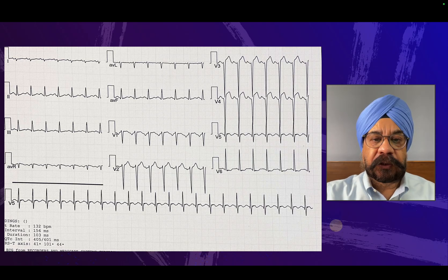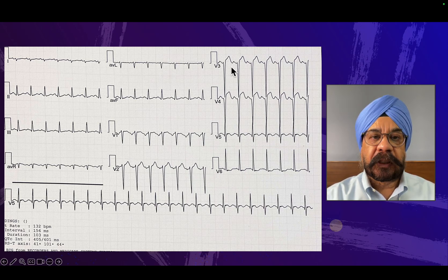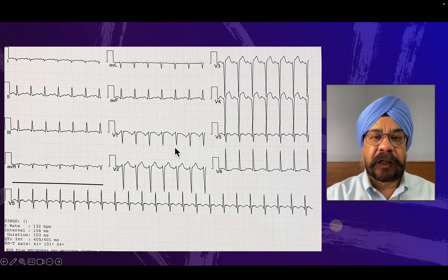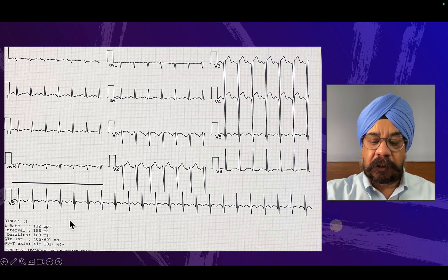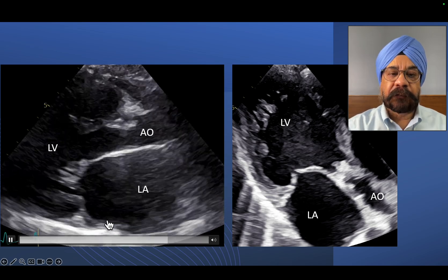On the ECG you see glaring left ventricular hypertrophy and a strain pattern, but there is an ST elevation which is noticeable in V3 and V4, more marked than other leads. Apart from that there is left atrial enlargement and the heart rate is sinus tachycardia. Let's begin with the echocardiography first.